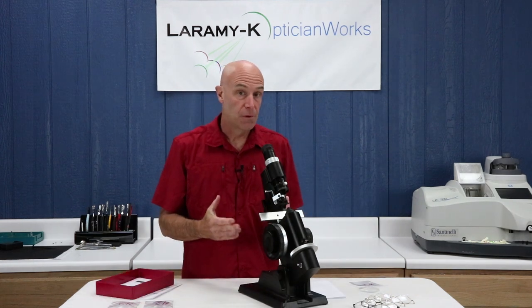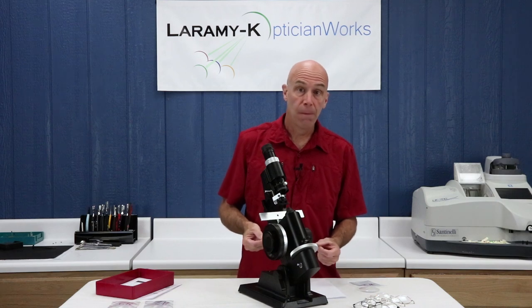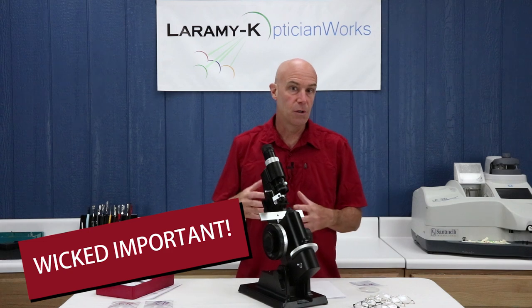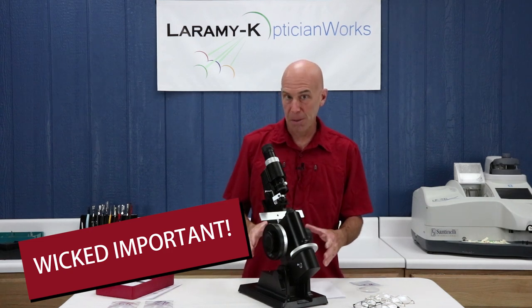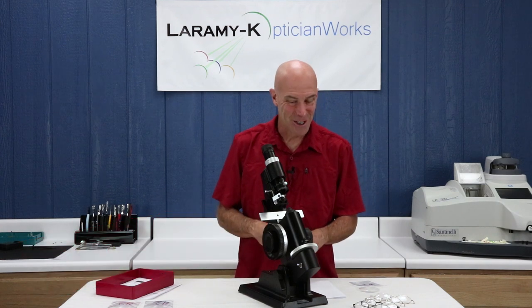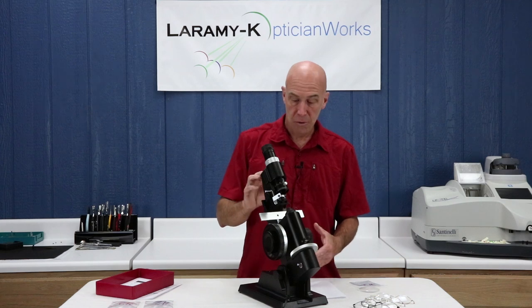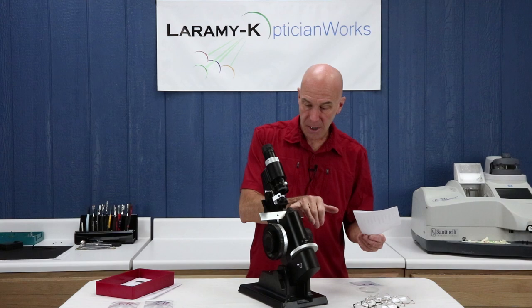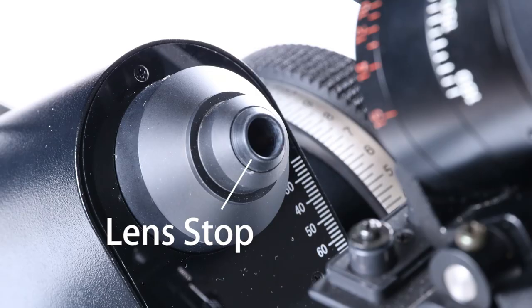Now I need to set it up for my individual eyesight. There are some very specific steps here that you're going to want to memorize, because if you don't do these before jumping into verification or layout work during any practical exam, you're not going to pass. So pay attention. You start to focus a lens meter for individual use by having it turned off. I take a sheet of white paper and rest it against this point right here, which is the lens stop.